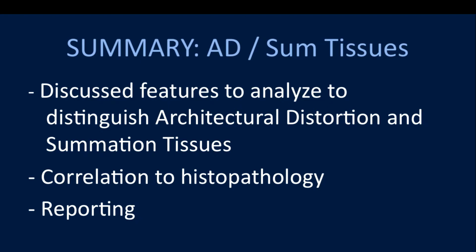But that's what got me thinking. I told the patient, 4 years ago, it is practice to now do surgical excision for these things after a benign biopsy. But I feel fairly confident that I hit this, and I'm willing with Tomo now to follow this, because I feel like I can see it better now with Tomo than I did with 2D. And it was just sort of anecdotally.